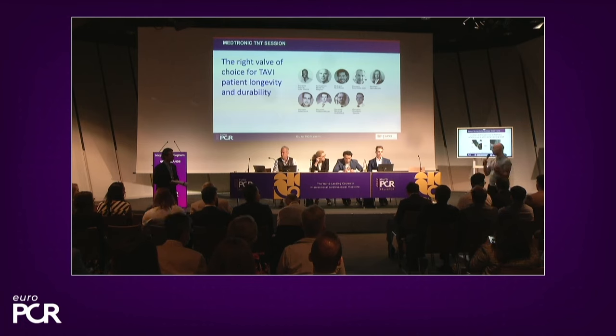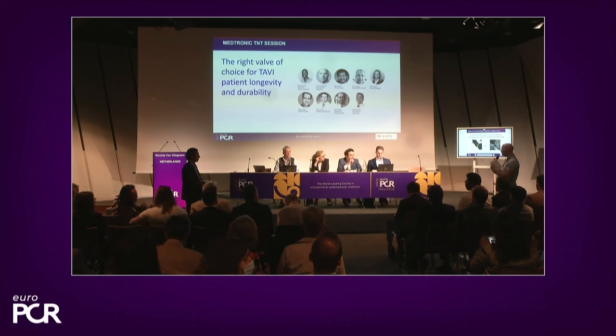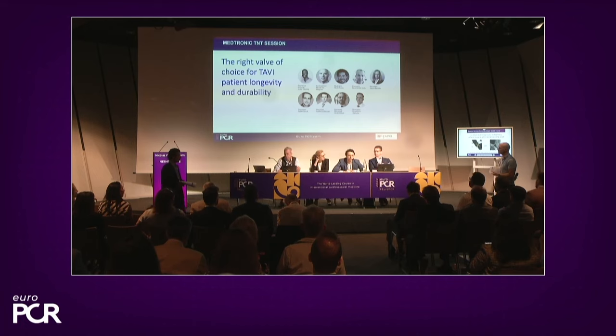So a first question to Guy, maybe, is what is your experience in these lower risk patients? Are you already doing it? How is that moving forward? Yeah, we're doing more and more low risk patients, young low risk patients, and it's very important for us to consider several aspects when doing this, folks. One of them, of course, is the durability of the valve, and the performance of the valve as well. The ability also to perform commissural alignment is extremely important for us to be able to have access to the coronary down the road.